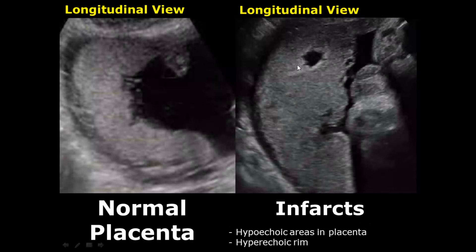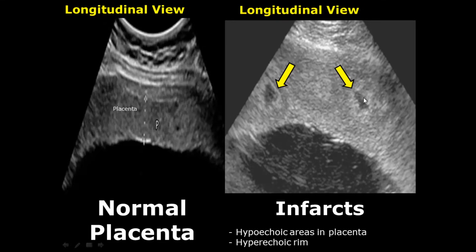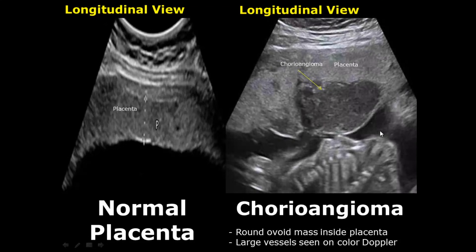Infarcts in the placenta appear as hypoechoic areas, but one distinguishing feature is that they have a hyperechoic bright rim. In this image you can see two infarcts — they are hypoechoic and have a hyperechoic rim.